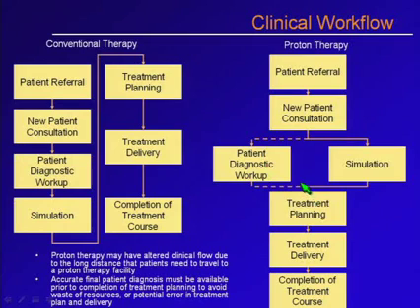So these are the sort of things you have to think about, how you're going to be dealing with the patient's comfort or convenience to make sure that they're not making too many extra trips for radiation treatments.